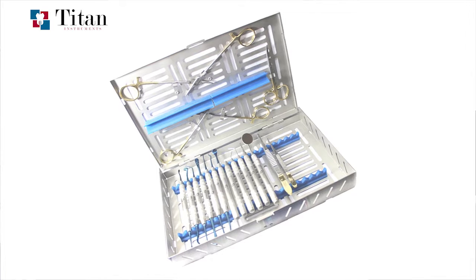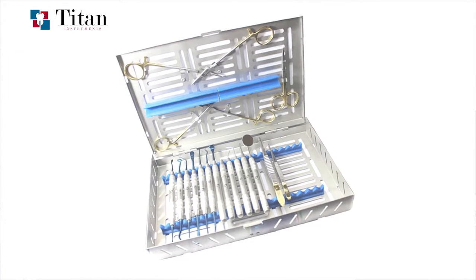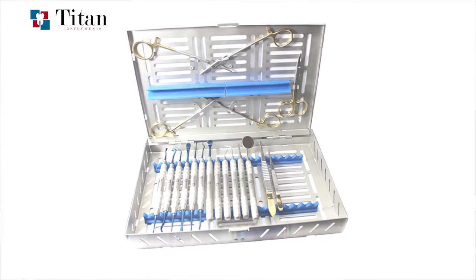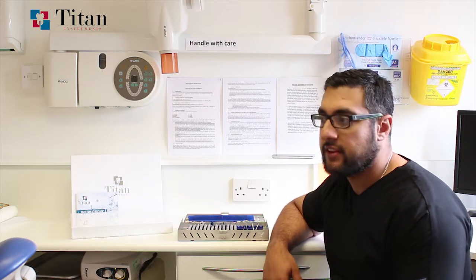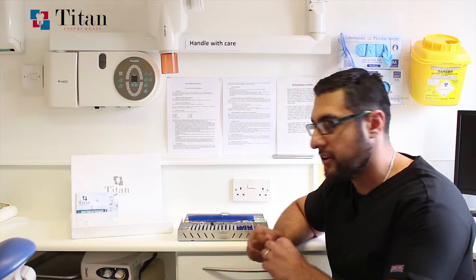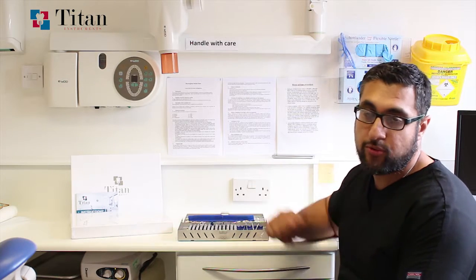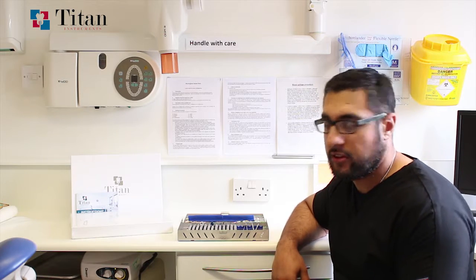Now let's go to the interior part of the kit. I wanted the flow of the kit to be exactly the same as when you're doing a general surgery — you inspect the site, make your incisions, lift the flap, place an implant, and then suture the flap closed. So the kit is designed to flow from the left hand side all the way to the right, copying that exact surgical flow.